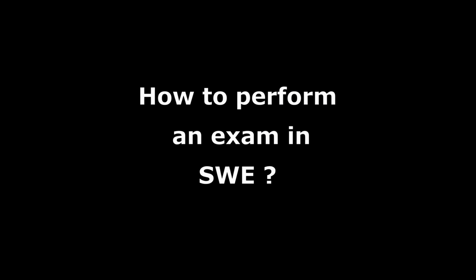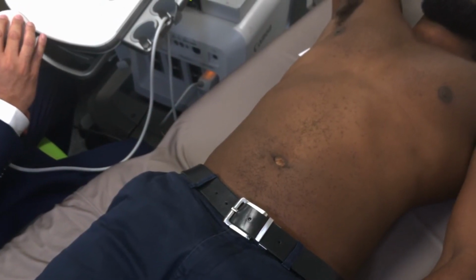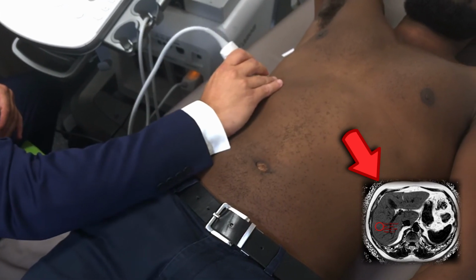How to perform a quick, reliable and reproducible exam? You have to follow some easy rules. Patient fasting at least 4 hours. Patient supine position, intercostal approach and measurement in segment 7 or 8.